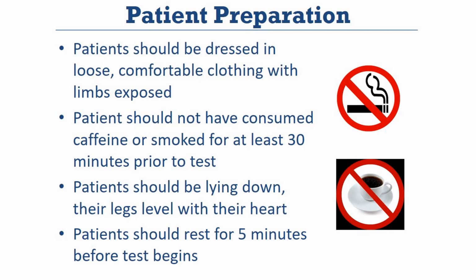Shorts and a t-shirt work well. Patients should not have consumed caffeine or tobacco in the 30 minutes before the start of the test. While performing the test, patients should be lying down with their legs level with their heart.